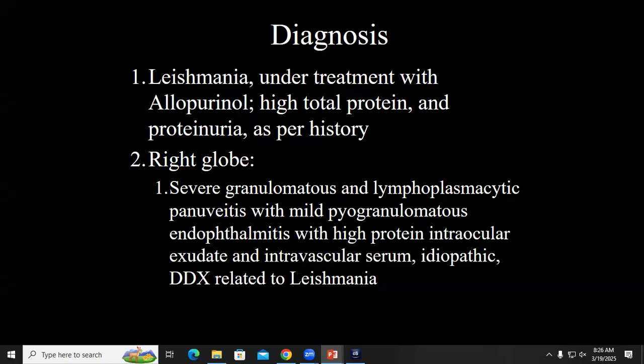When I said I think I know why it didn't, that's exactly why. I agree. Hemorrhage and necrosis. But certainly the high protein intraocular exudate is strongly suggestive of it. And yes, I probably should have used that somewhere in the diagnosis so we could find it again. If you put hyperviscosity there, I wouldn't mind at all either. Okay, cool.